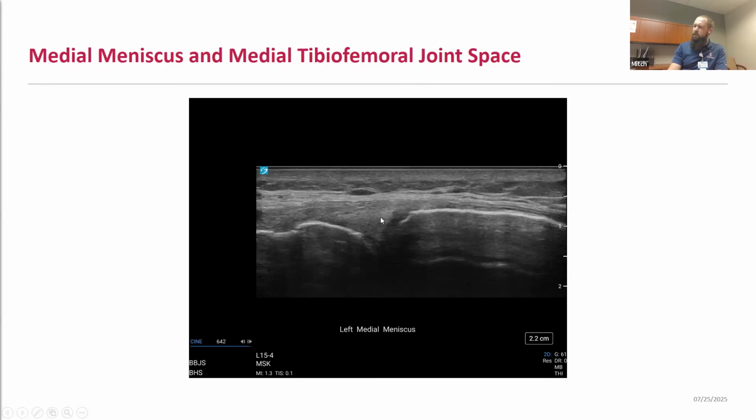And so you'll follow the meniscus from the anterior horn out here coronally to the body underneath the MCL. And then you can follow it to the posterior horn at the posterior aspect of the knee as well. Again, depending on your patient, the size of the patient, sometimes to get good visualization of that posterior horn of the medial meniscus, you may need to use a curvilinear probe. But again, a lot of times you can get away with that linear probe to evaluate for these.